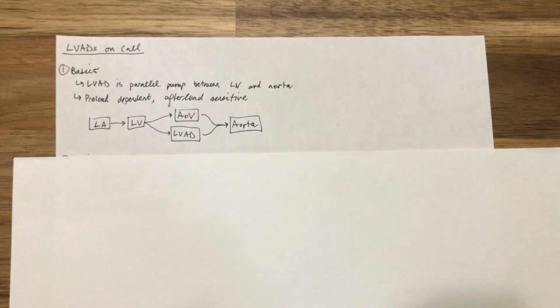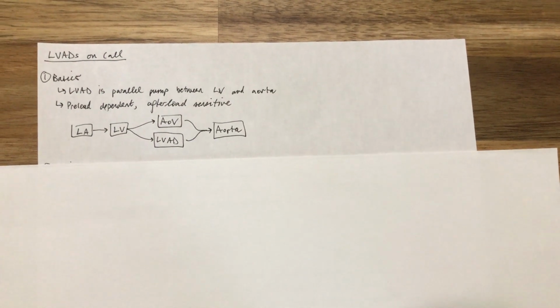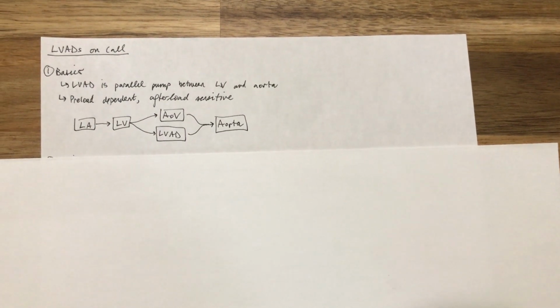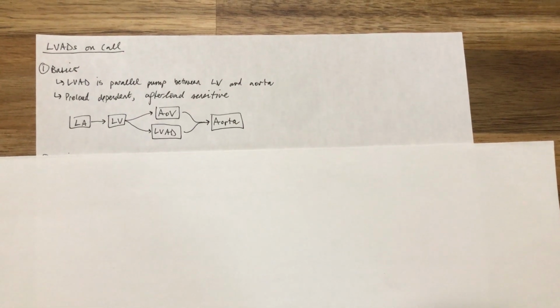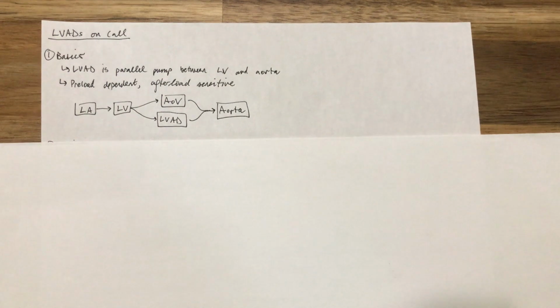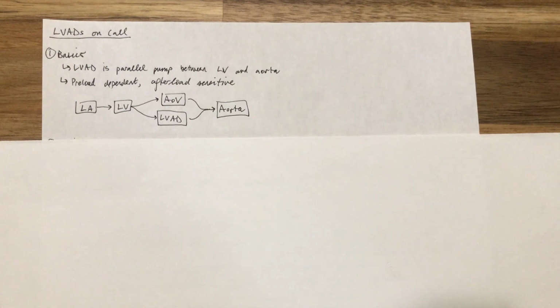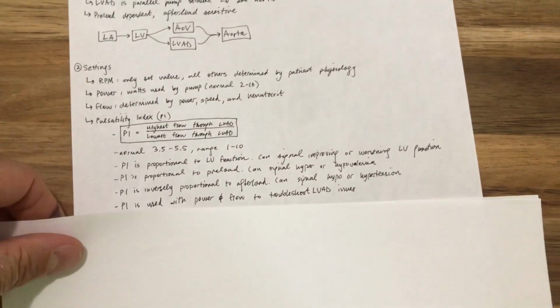The basics of these VADs is that it is a parallel pump between the LV and the aorta, and they are preload dependent and afterload sensitive. We're going to continue to come back to that very key concept throughout the talk, so keep that in mind. I drew a diagram here of how I think of LVAD flow. Next we'll go to the settings of these VADs.